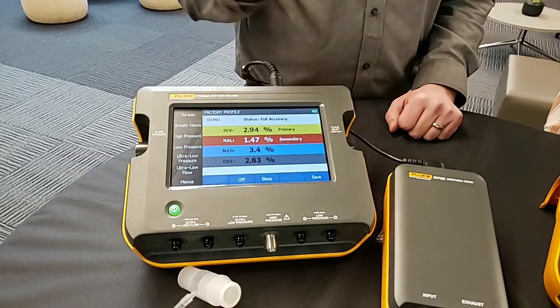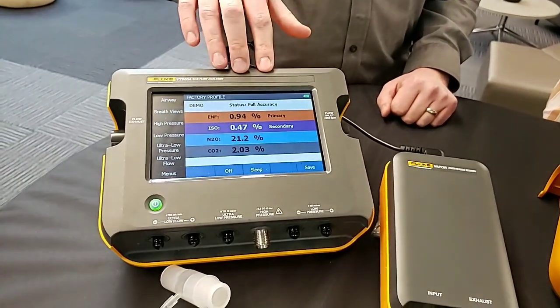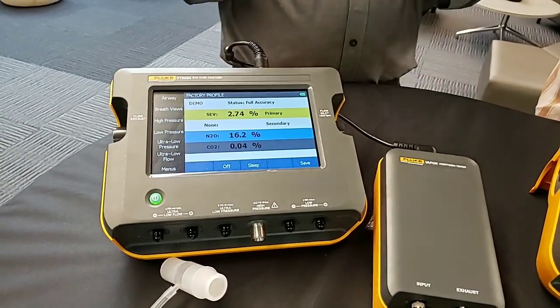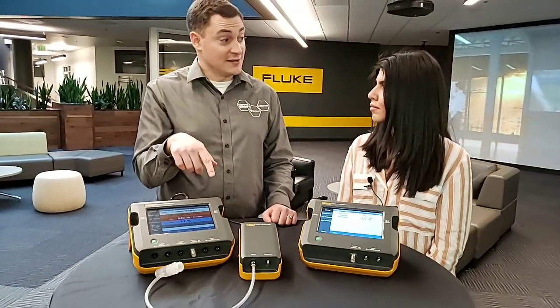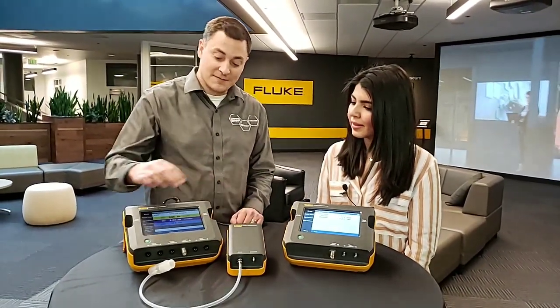Helpful. The other thing you'll see is through the color touchscreen display, we're able to see the international color code of each gas. This is the same across the globe. And this is a really cool feature that allows you to say, hey, did I turn sevoflurane on? Am I seeing yellow? It's a nice quick check, and it's a nice way to see everything.